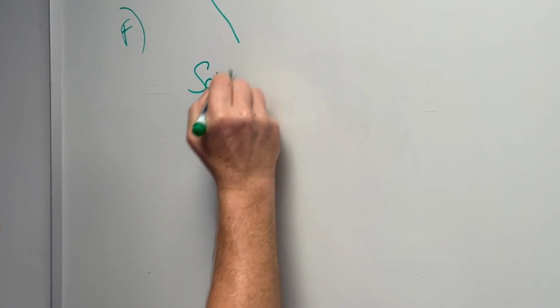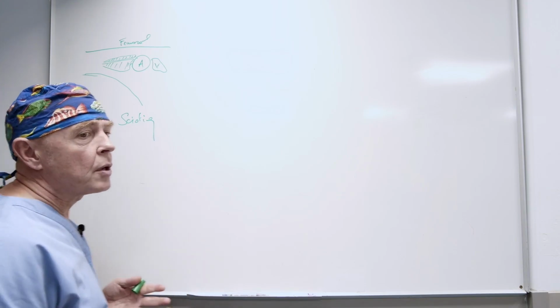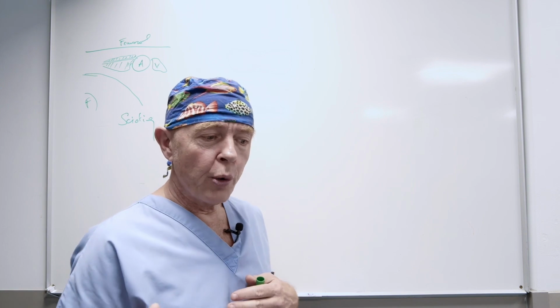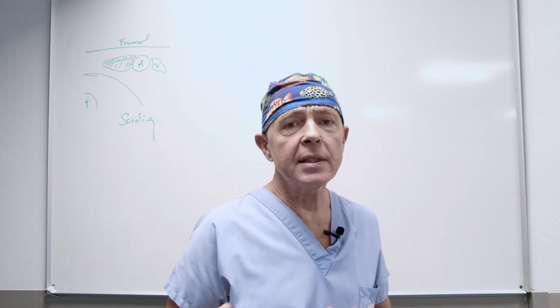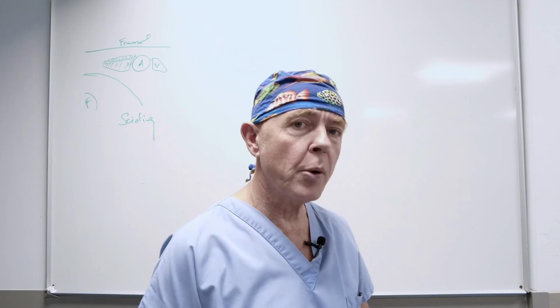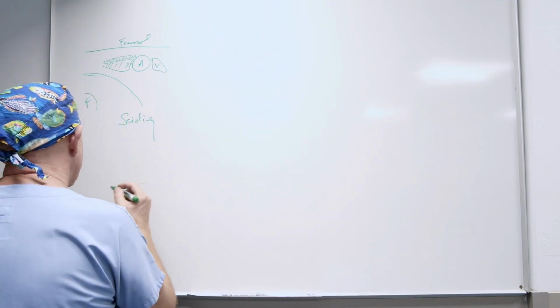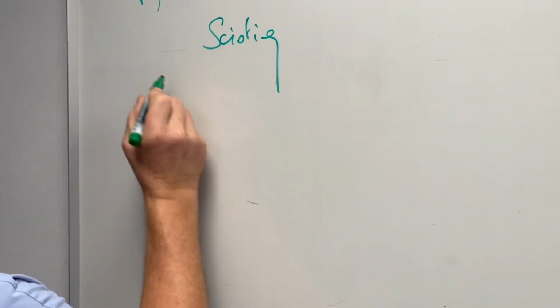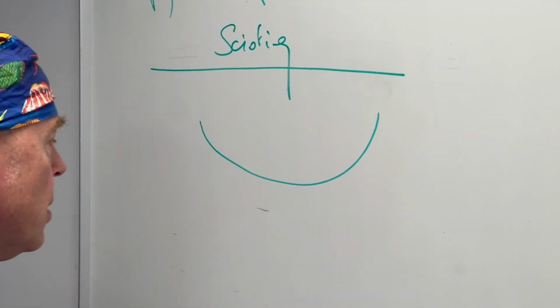Sciatic nerve. At the subgluteal level. Very often it is a nerve that is more superficial than we think. It is located approximately between 4 and 6 centimeters, whereas when approached a little lower, it can go deeper. Consequently, the primary anatomical landmarks are consistently the dermal layer, the gluteal muscle, the femur bone, and the ischium.